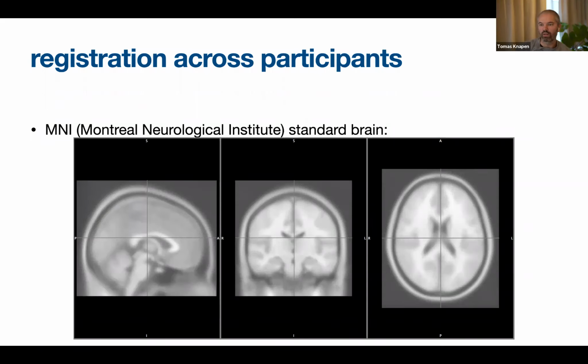What you also see is that there's some detail here still in the middle, and especially if you take the PDF of this slide and zoom in a bit, you really see that this all looks pretty detailed still, right? You can actually see where things are. But if you look at the cortex here, that's all mushed together. That's like appelmoes. So that's not something that we can use, right?